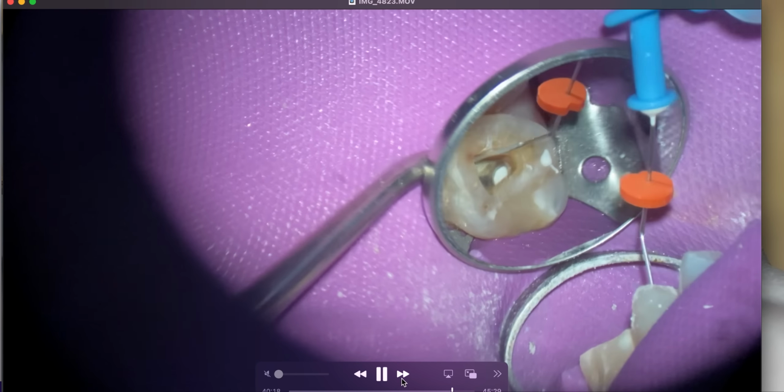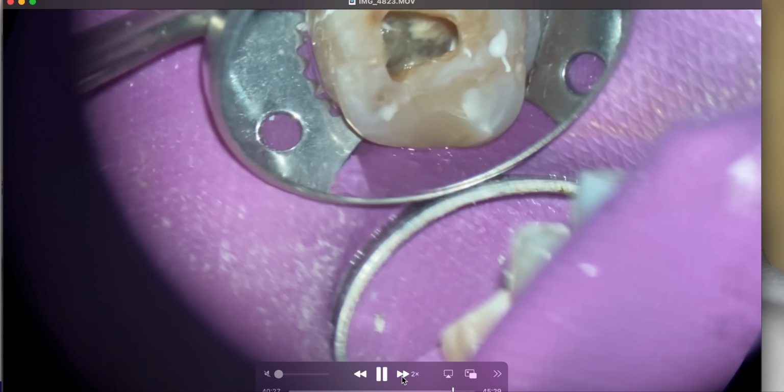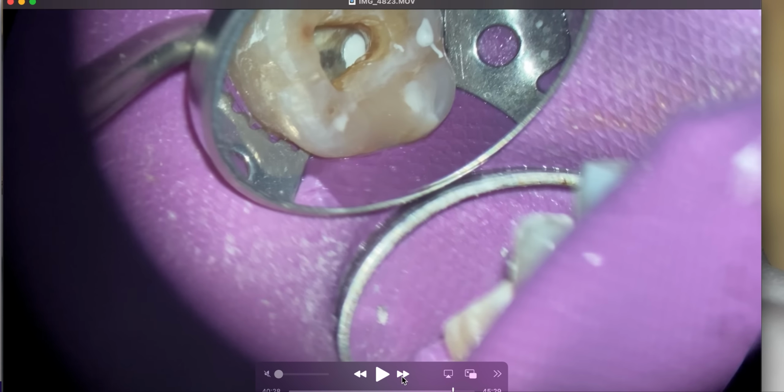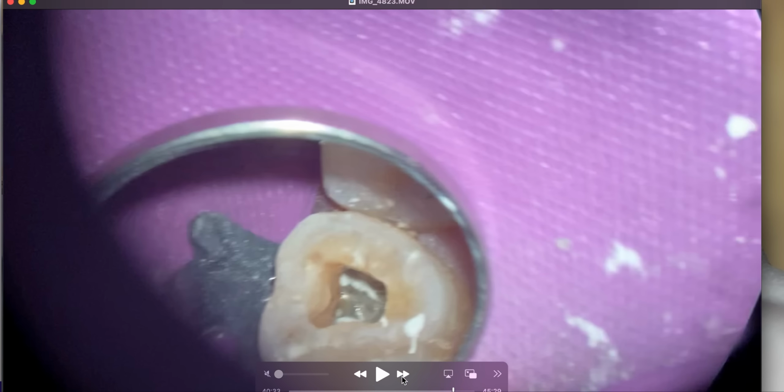Okay, so we're going to place that. And then we're going to place powder calcium hydroxide. Okay, so here's the hero shot. There's calcium hydroxide in the palate. There's calcium hydroxide in MB1, MB2.